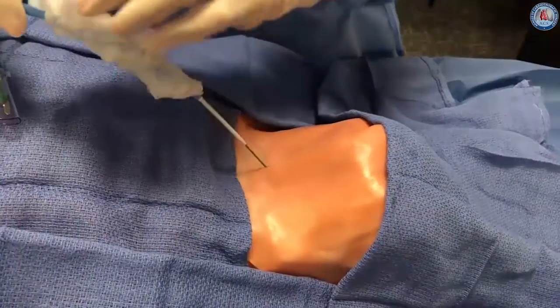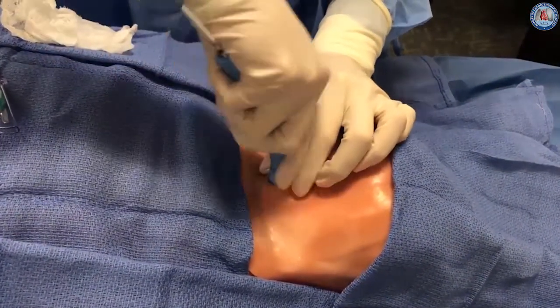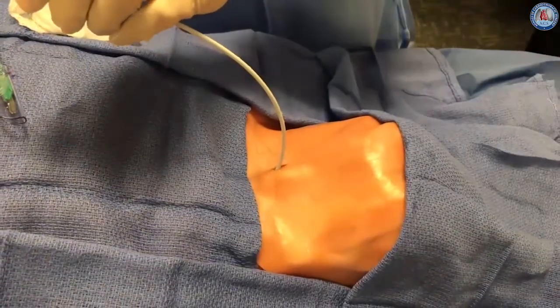The hydrophilic coated Blue Rhino dilator, moistened with saline and fitted over the guiding catheter, is advanced over the guide wire as an assembly and into the trachea. The Blue Rhino dilator is then removed, leaving the guiding catheter and guide wire in place.